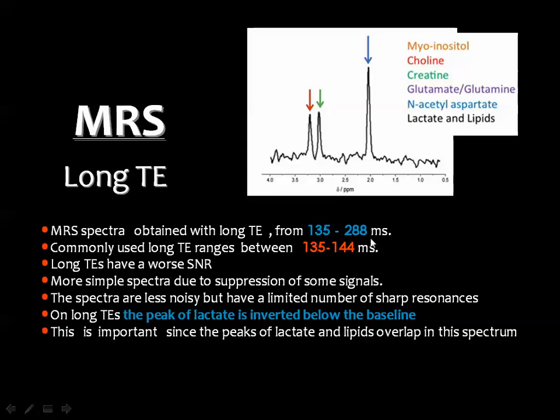But nowadays it is standard to use only two echo times, the short one and the long one, in these ranges.